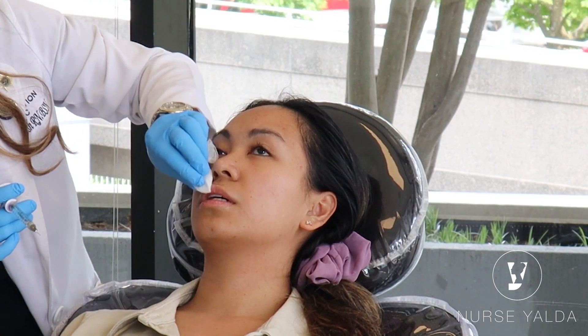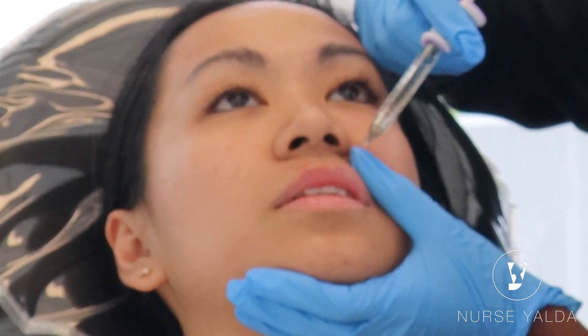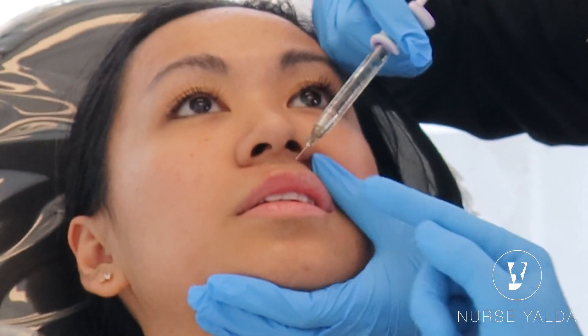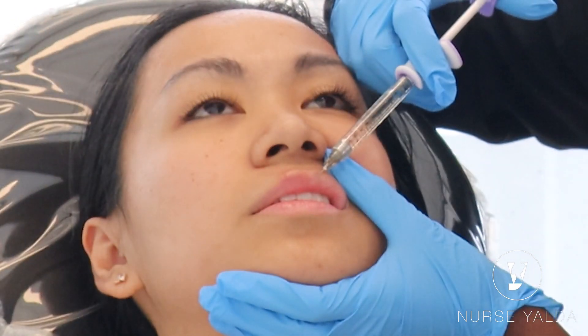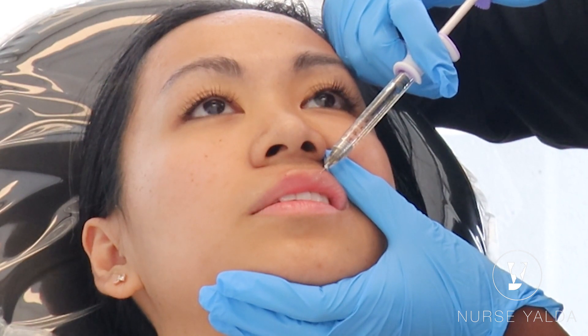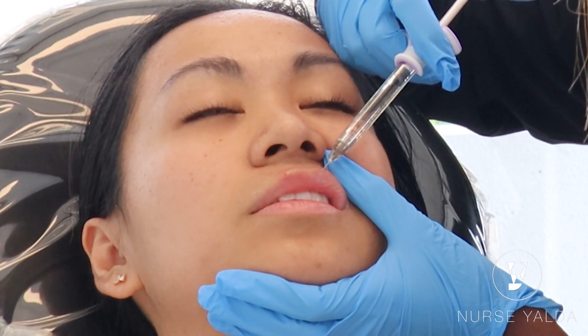See how much more elevation that gives? Let's do the other side. Follow that little V — imagine there's a V and we're going to follow it because we want to contour. You're perfect. Now go ahead and place your finger and make sure you're pushing the pout out really well.